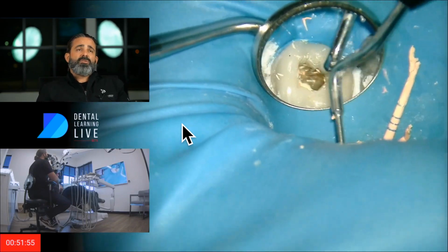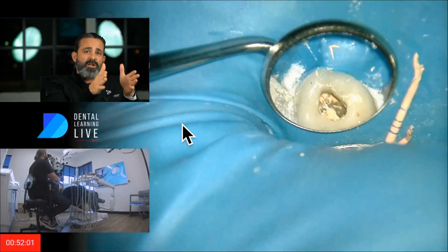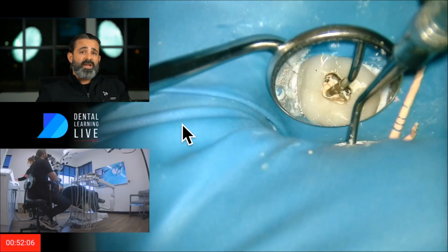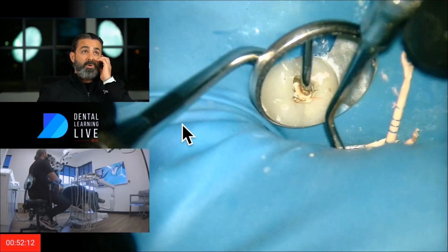Kind of like the little lateral condensation days, but with just a wedge force plugger pushing directly on it and forcing it in. And you'd be surprised how far your sealer goes in that. It's a true plunger effect. But it's very effective in those smaller sizes to obturate smaller and smaller spaces.